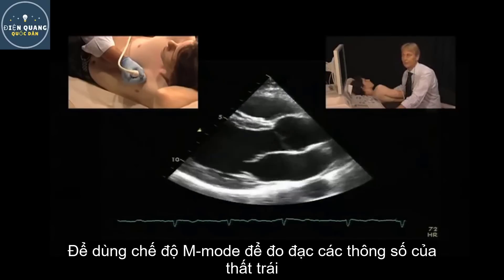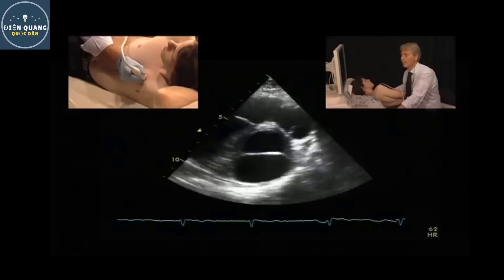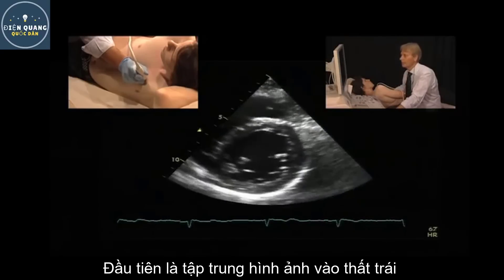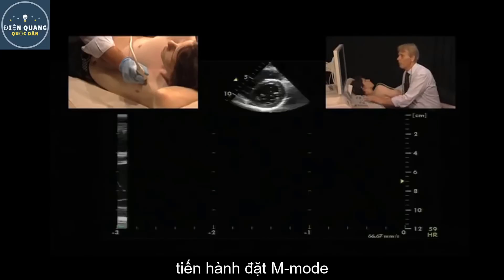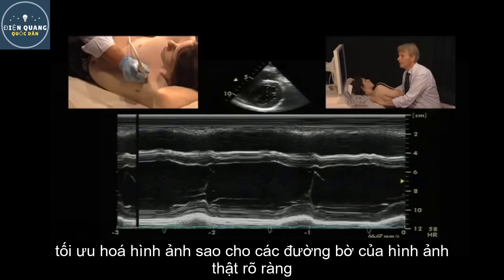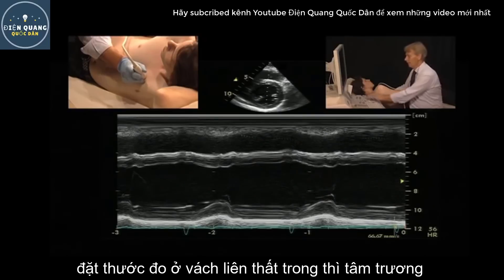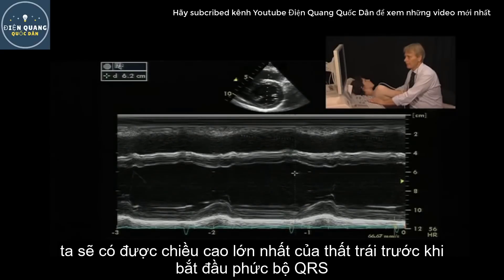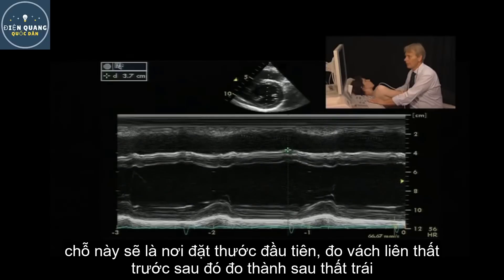To perform an M-mode measurement of the left ventricle you need a parasternal long or short axis view — you can actually do it from both. The first thing you have to look into is whether the ventricle is really round, as this is important for the reasons already mentioned. Once you have a nice view of the left ventricle, you will put the M-mode exactly through the middle of the left ventricle and optimize the image so that you have a very good contour. Then freeze the image and perform the measurement of the septum at diastole — we have the biggest width of the left ventricle shortly before the QRS complex starts.